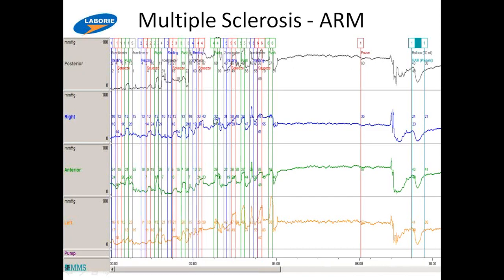This is a very nice lady who was 55 years old and had moderately severe MS. She was already having difficulty with ambulation and documented bladder outlet dysfunction. She presented with constipation. You'd think, oh, is she going to be incontinent? Well, you can present with either one, but she would go days without a BM and have to digitalize frequently. On exam, I thought she had a normal resting tone, was good, but not squeezed at all. And that pretty much correlated with what we found.